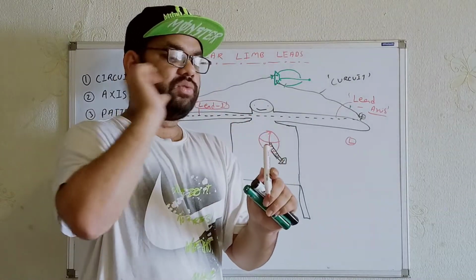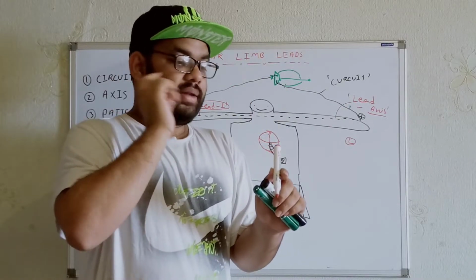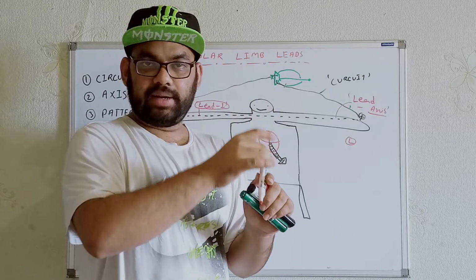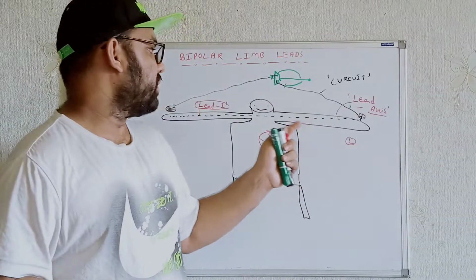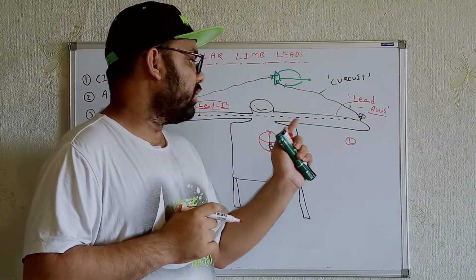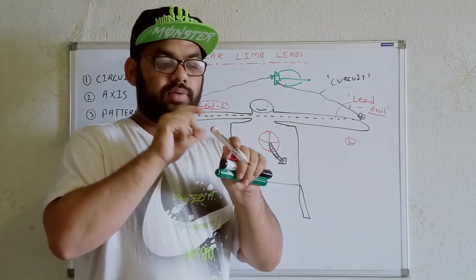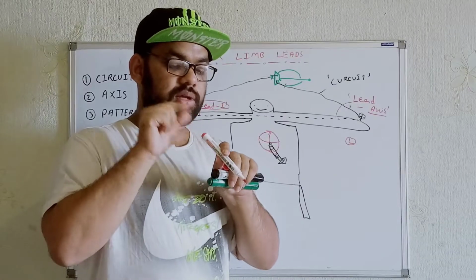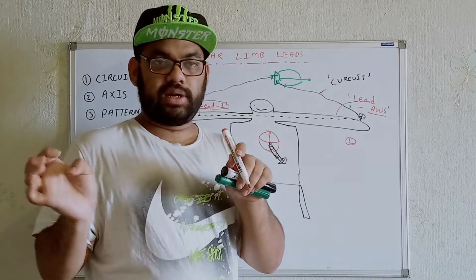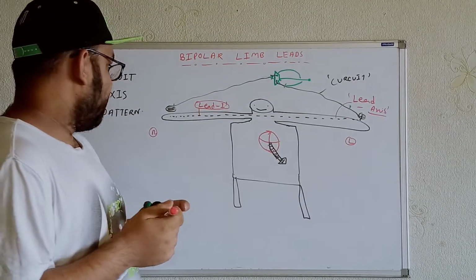Now if we use any lead that is going from left to right, just like this, we will get only the superior view of the electrical vectors. To represent the whole thing, I have to get the view from different directions. If it goes downward and leftward, I have to get the view from this side and also from this side. That's why I have to use more leads over here.